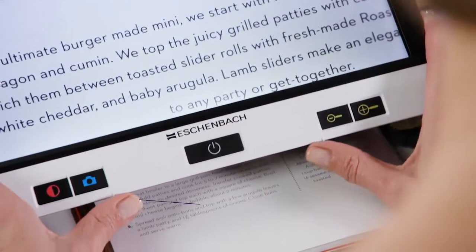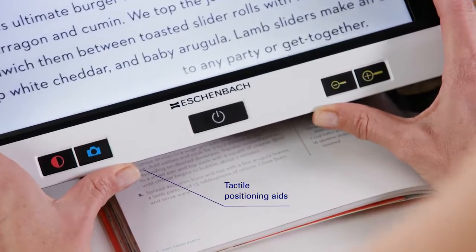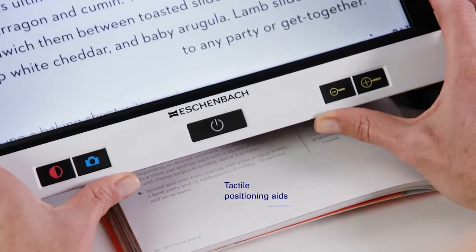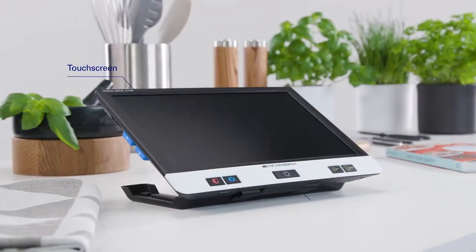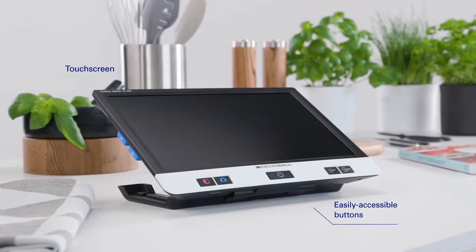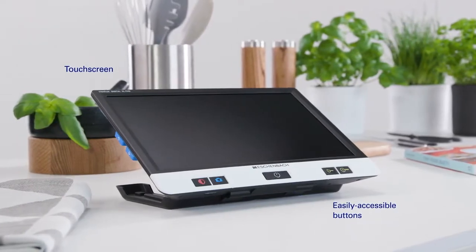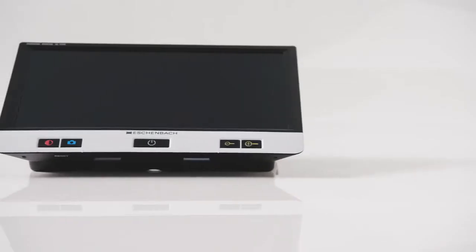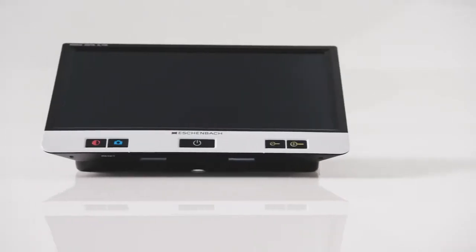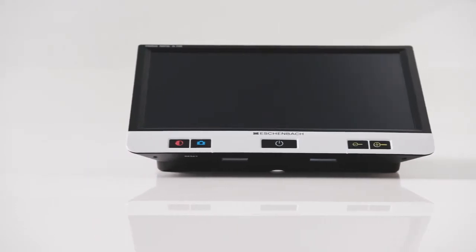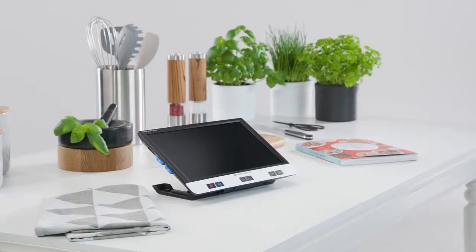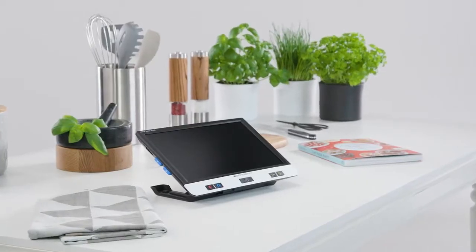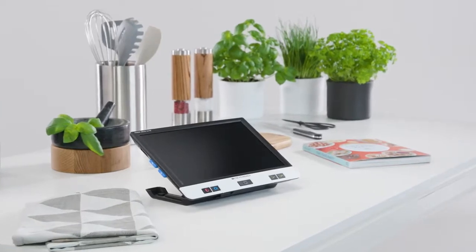Tactile positioning aids enable optimal orientation. Thanks to its touch screen and easily accessible buttons, it is intuitive to use. Due to these and many other product features, the Visolux Digital XL FHD offers optimal all-round reading comfort.